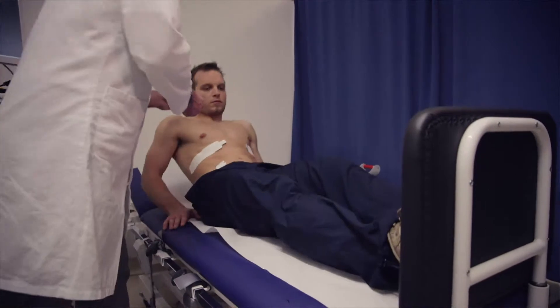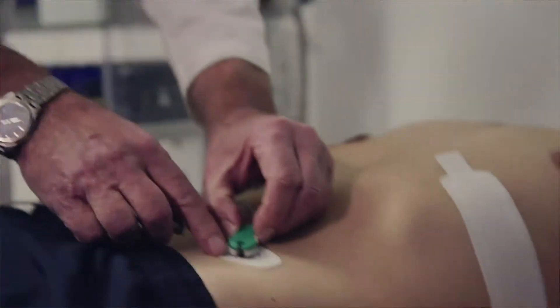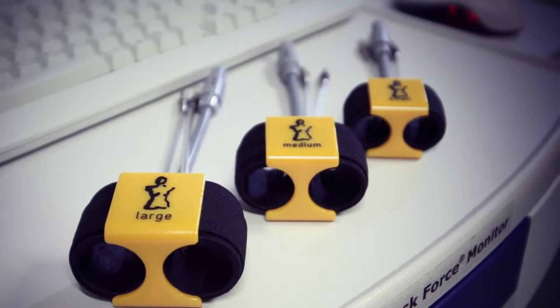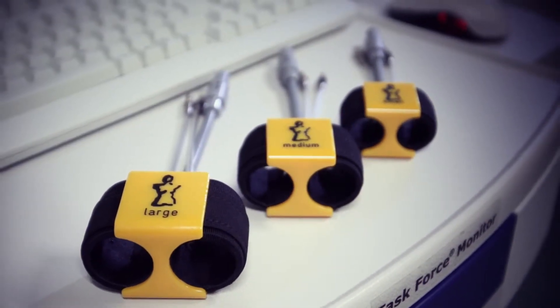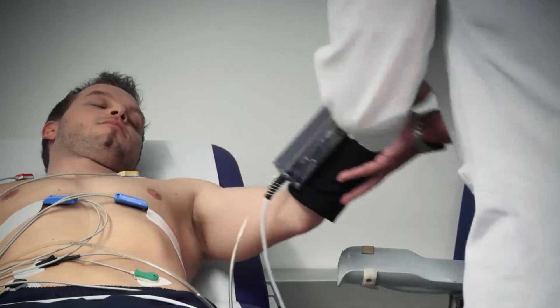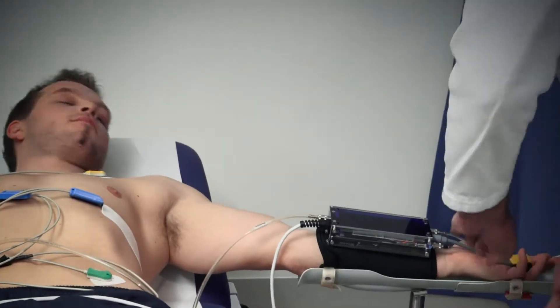For the setup of the electrocardiogram, use the four spot electrodes to derive the six ECG channels. A finger cuff — either large, medium, or small — is selected and connected to the forearm unit. The patient's fingers are then placed into the cuff.